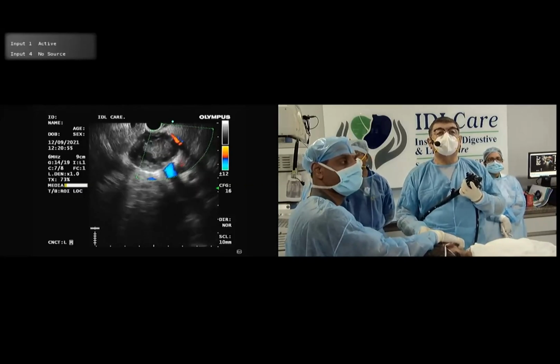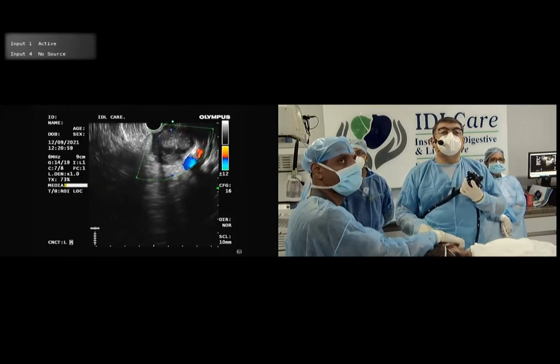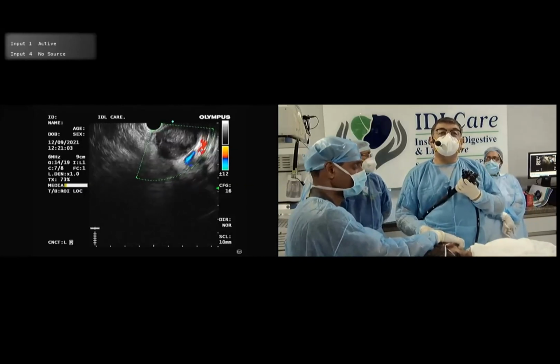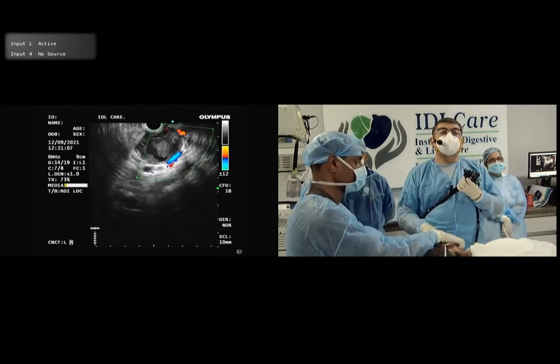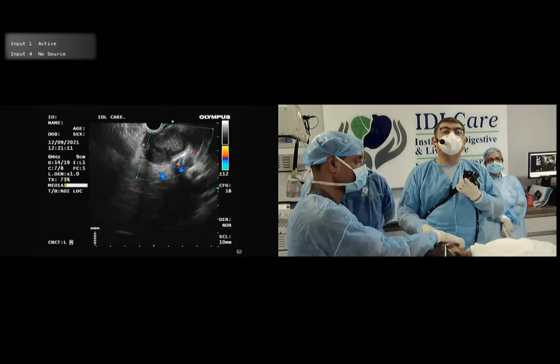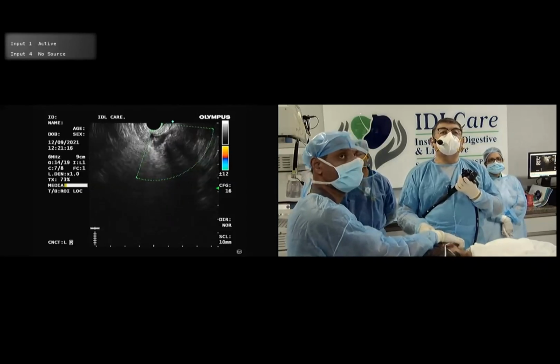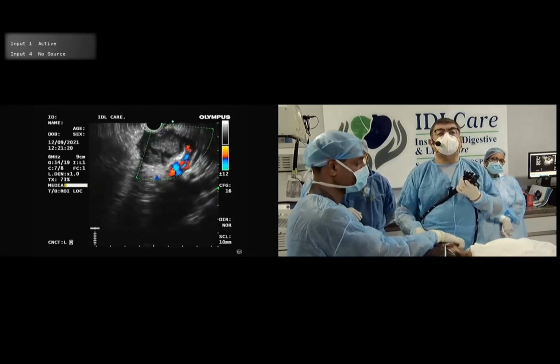My first impression would be pancreatitis, although surprisingly, there is no history of any significant pain. You see the splenic vessel underneath? It's nicely coursing underneath. There is no problem here. Some free fluid, very small amount of free fluid. So this is all the information we have got from the stomach.